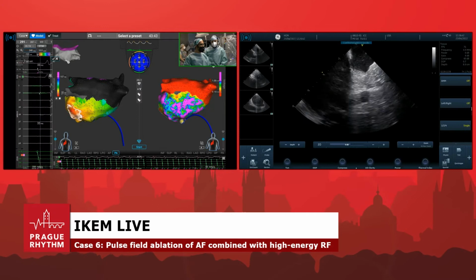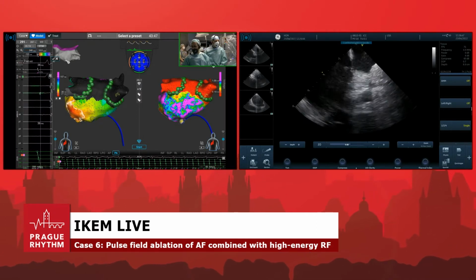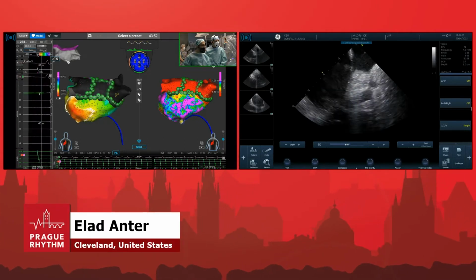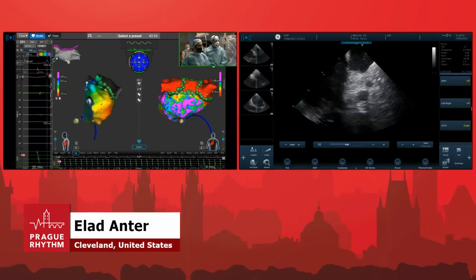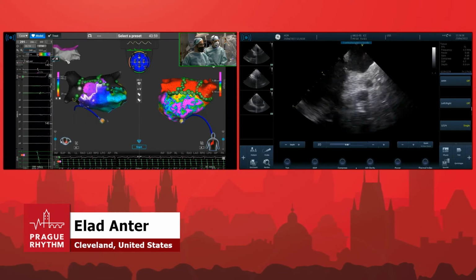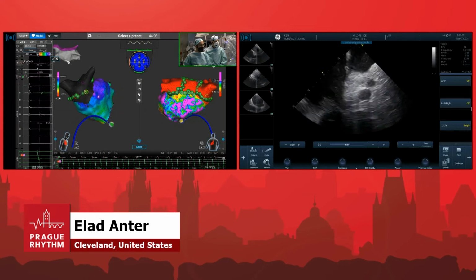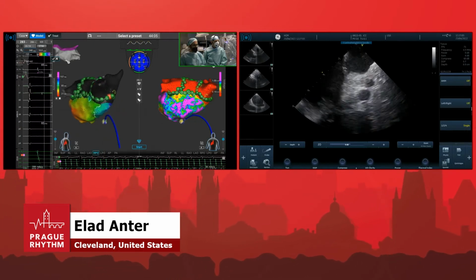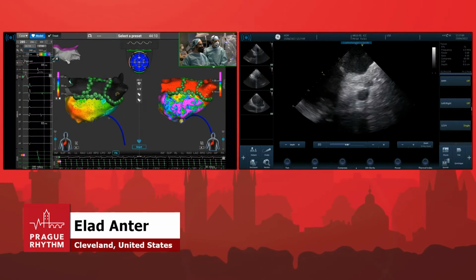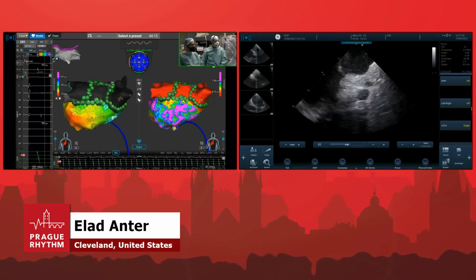So this is the voltage map post-isolation and the activation map, and I think you can see this on your monitor. Maybe you can just rotate the map a little bit. This map was done during CS pacing. You can see that there is entrance block into the veins and into the posterior wall.